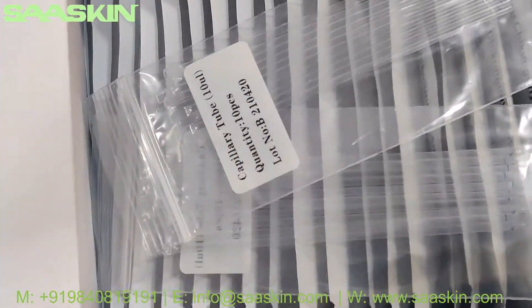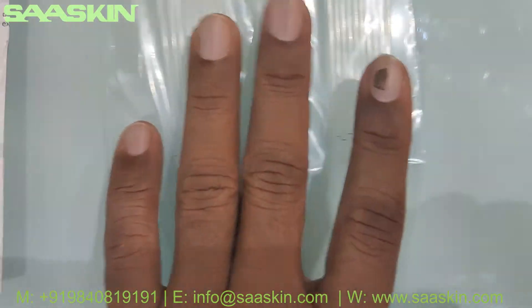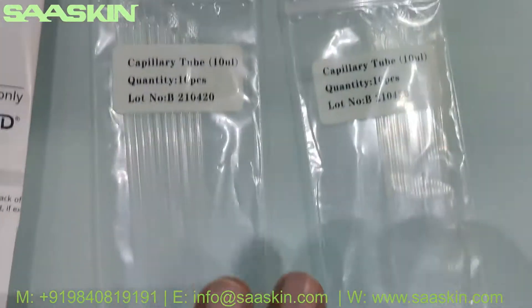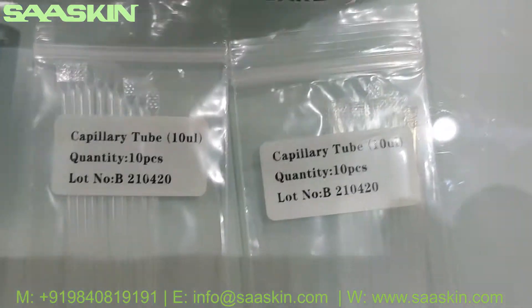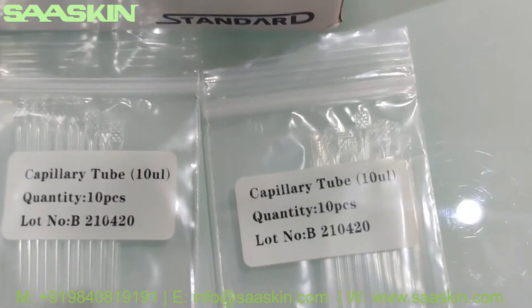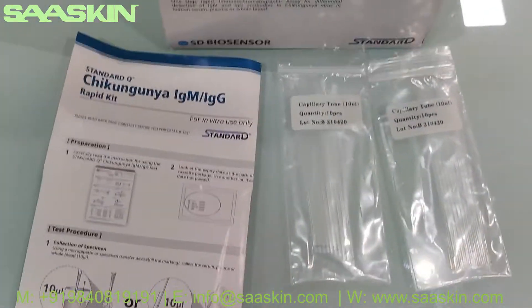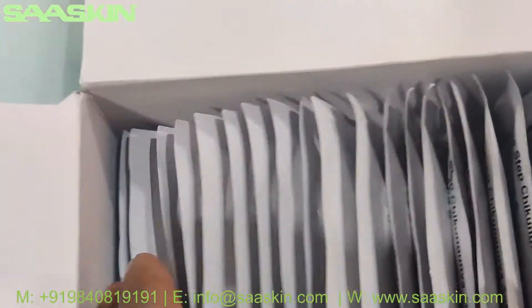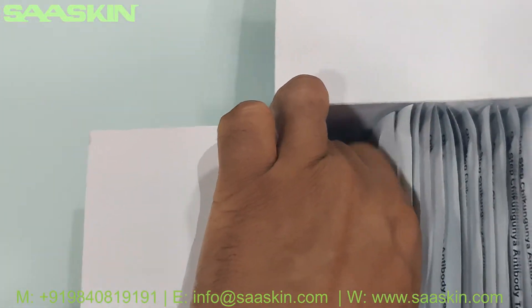Inside the box, since this is a 20-test kit box, you have 20 pieces of specimen transfer device — 10 packs in each. You can see it's a 10-microliter capillary tube used for specimen transfer. You've got 20 pieces, 10 pieces in each pack.